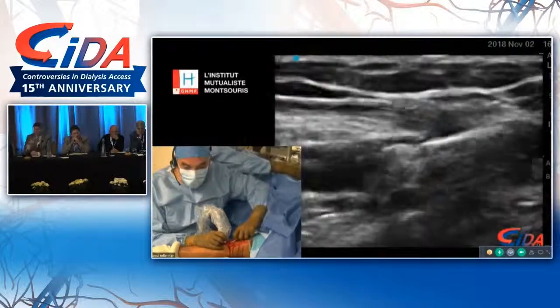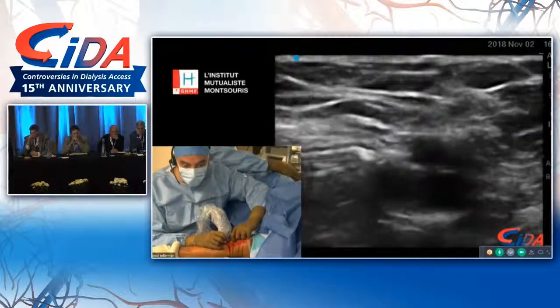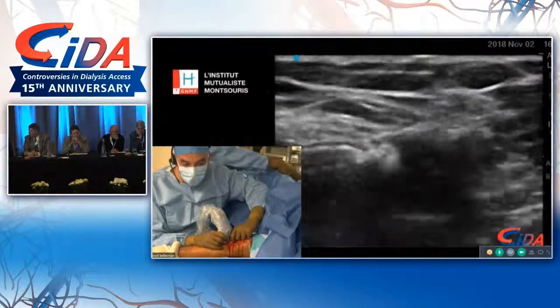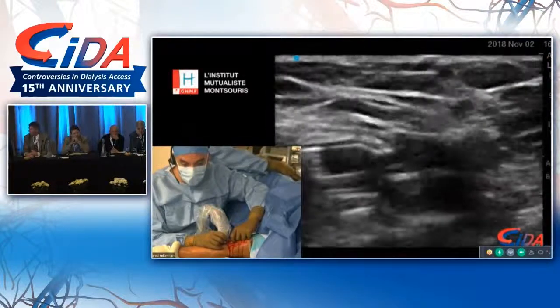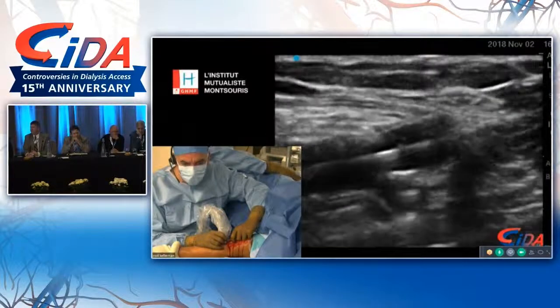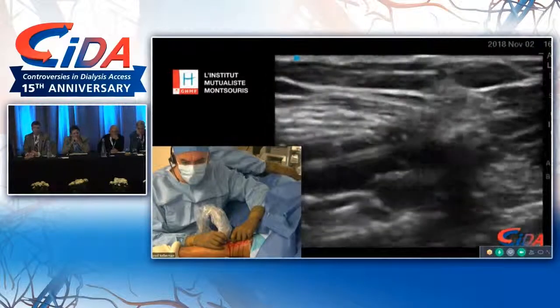So we are inflating, and I'm going to hold the sheath because the balloon we're going to try to push back, and I'm going to hold it with the sheath in place. Okay, you see there is some waisting. And you see that the waisting is almost done.